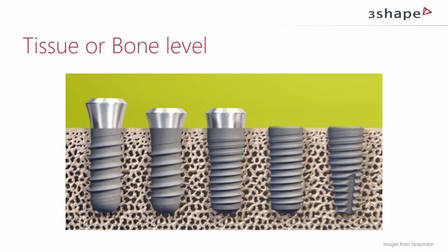So you get to travel a lot, I know, Jan, and talk with dentists and surgeons and also dental labs from all over the world. What is the trend these days? Is it possible to say anything about more implants moving in the direction of being placed as bone level implants, or does it depend on experience, preference mostly locally?